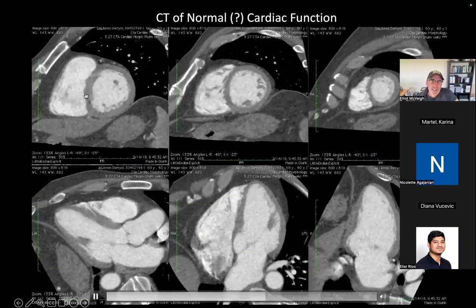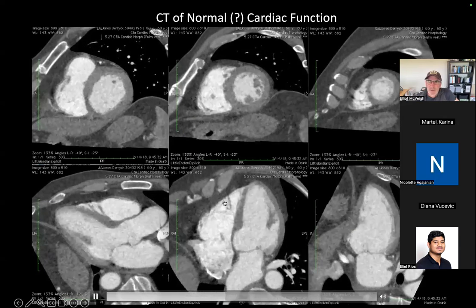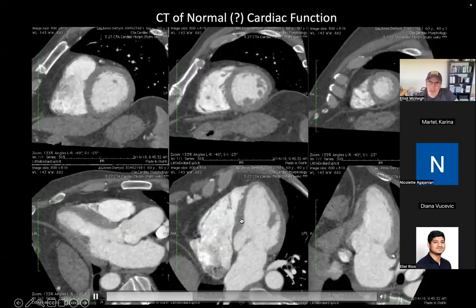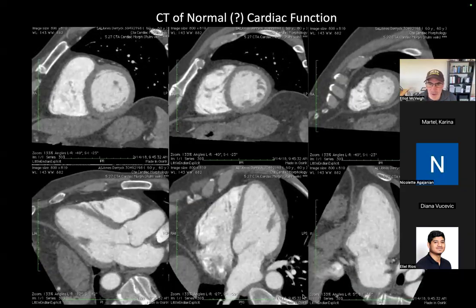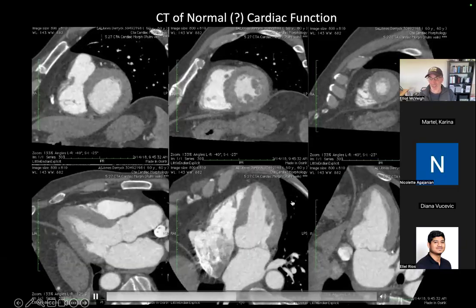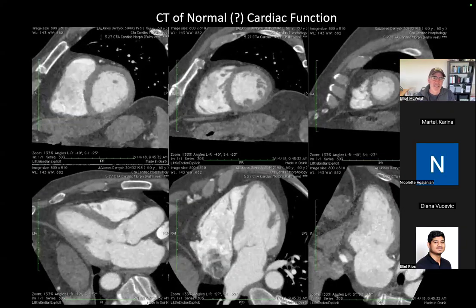This is a bit of a sensitive area because we're getting close to the valve plane. But then when we look at the long axis view and we see that our septum really shrinks down and becomes quite narrow here, well, that's an indication that this part of this person's heart, this wall right here, has undergone some kind of malady, right? It's probably an infarct right there.